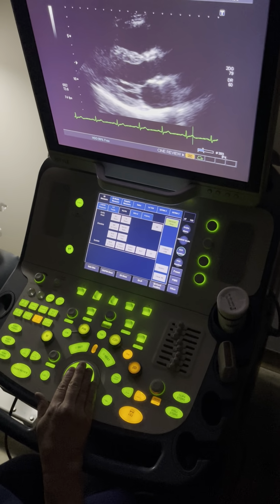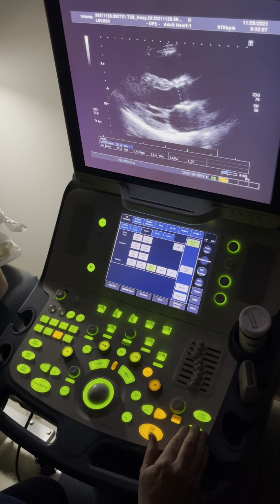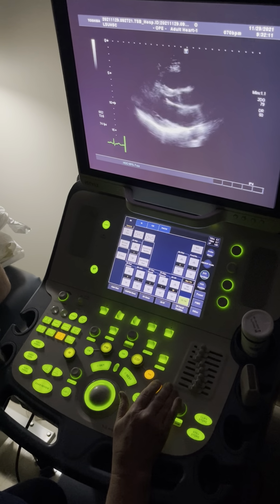I'm going to scroll to somewhere during systole. It's on the aortic page. It's down here at the bottom. It says LV outflow tract diameter. Anything between 18 and 22 I would not question your measurement, okay? So now I've done everything I need to do there.